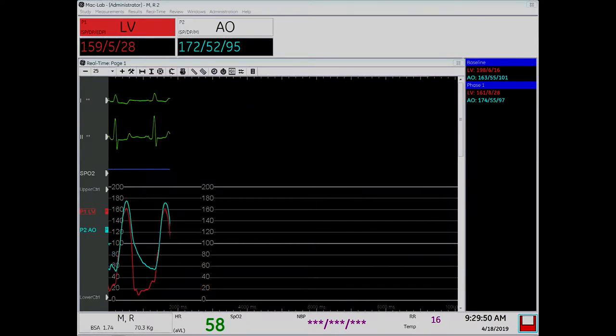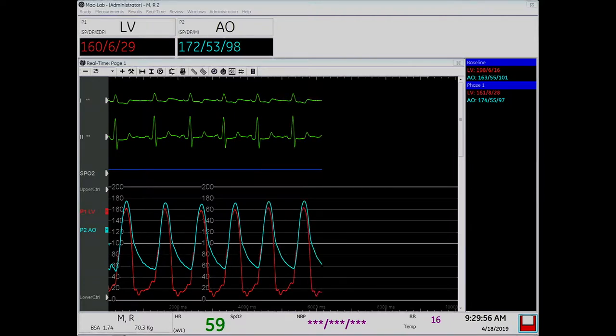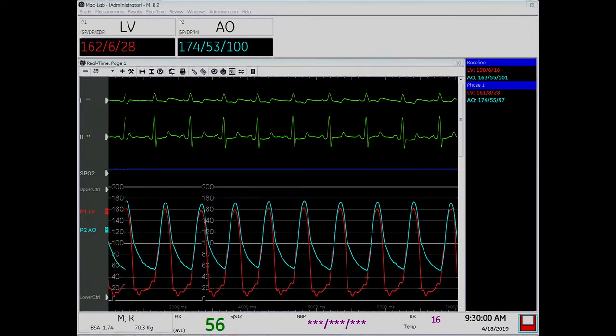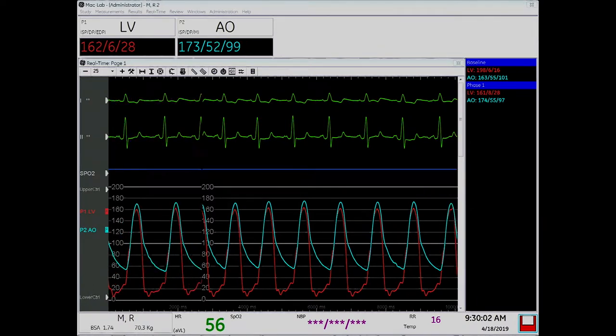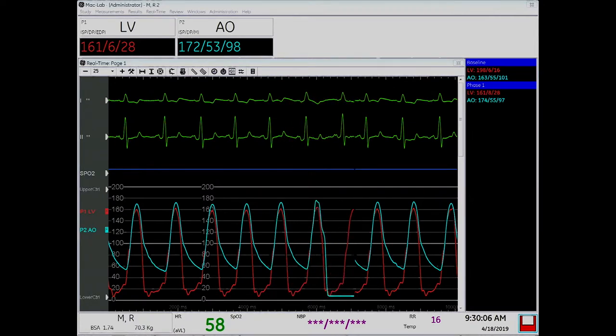We can do the AR index. Now, we pace this patient a lot, so the diastolic pressure is up to 22, 25. So the other one is now 60, so that's 35 over 180. The index is like 0.2. The index is not so perfect, so we'll see.